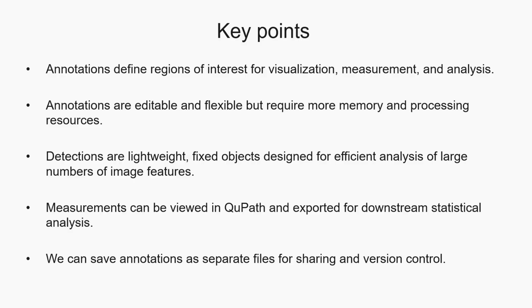Finally, annotations are not just visual objects. They can generate quantitative measurements that can be inspected within QuPath and exported for further statistical analysis, making them a critical bridge between image viewing and data analysis.